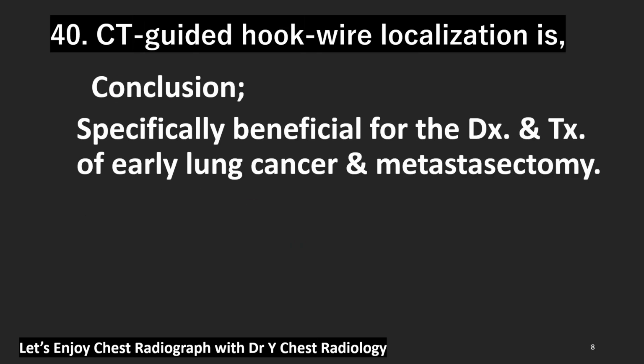So in conclusion, I can say that the CT-guided hook wire localization is specifically beneficial for the diagnosis and treatment of early small lung cancer such as adenocarcinoma of GGN and a tiny metastasectomy.